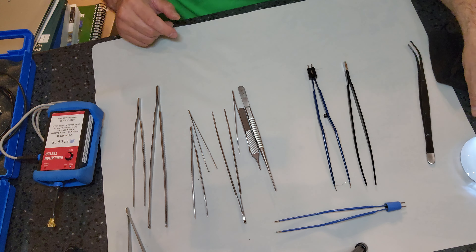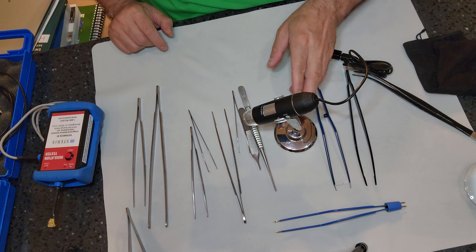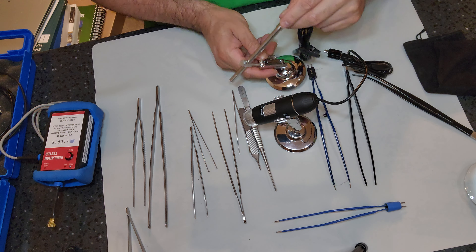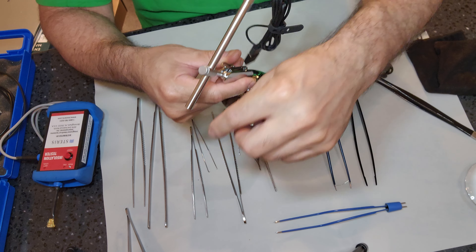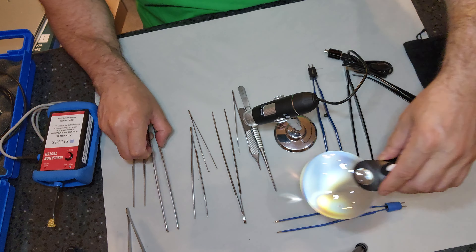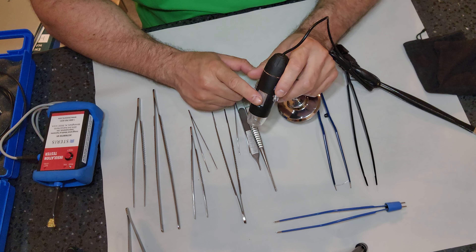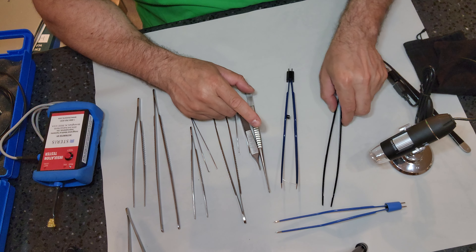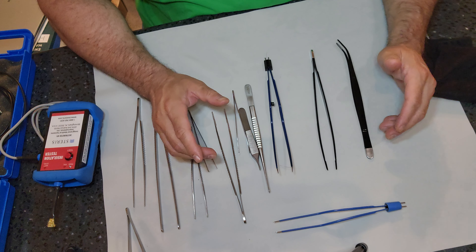One other specialty to cover: if you have light and magnification, that's great, but there are other tools as well. You have USB microscopes — a couple of varieties. One here is a 200x zoom pin-style that you can take off the mount to zoom in. With microscopes you need a steady hand and picture because it goes out of focus very easily. Even though there's a focus ring, keep it stationary and take the instruments to the field of view. These are the different magnifiers and tools you need to properly inspect and test your forceps.